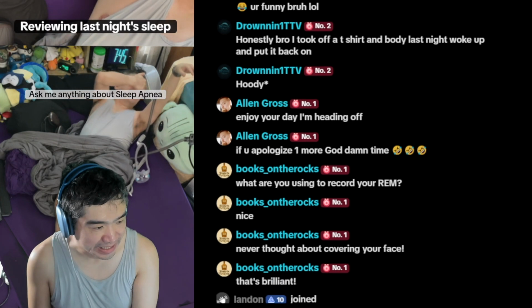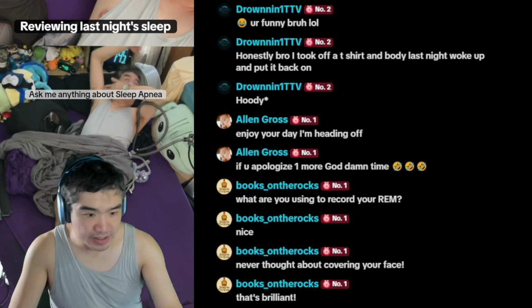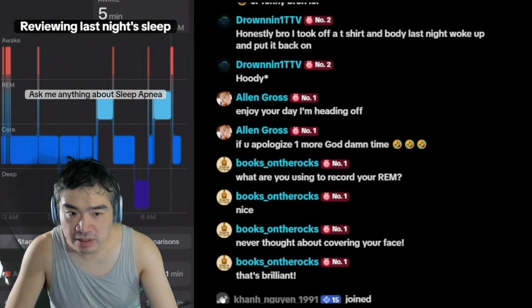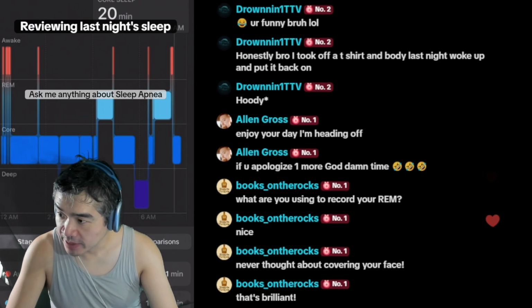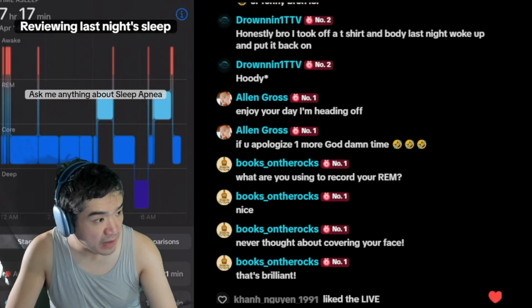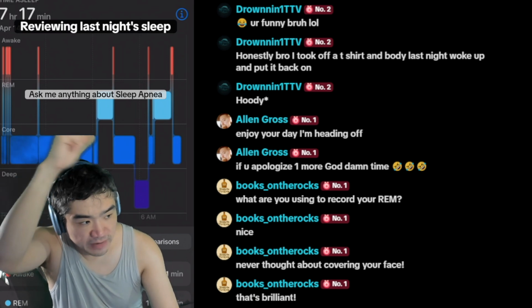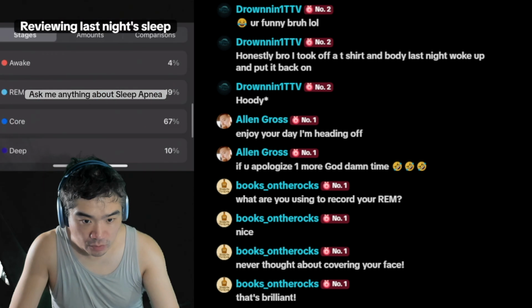Oh, look at that big yawn. All right, so that was the end of sleep. That was 7:45. Did it record me going back? Yeah, it did. So I did go back into a light sleep for about 20 minutes. All right, so all said and done, I had 7.5 hours. Again, 7:17 rounded up with various moments awake that I can fact check that were wrong.